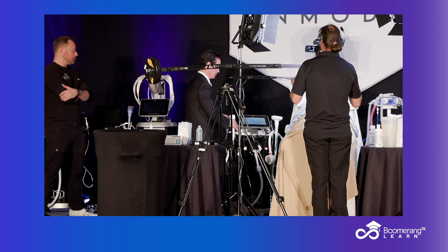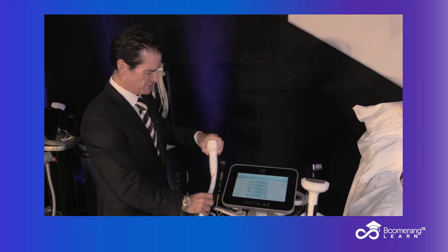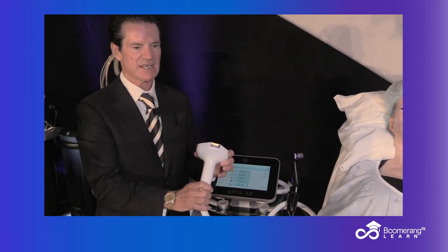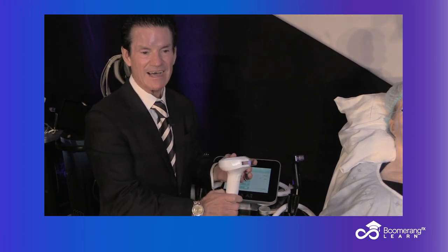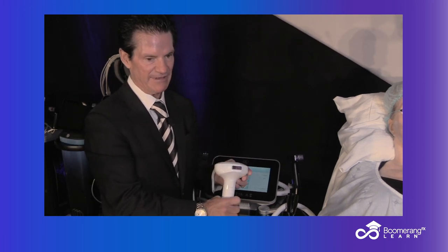We have looked at laser hair removal and the diode on the Optimus. And we are going to now look at one of my favorite energy-based devices: IPL photorejuvenation, or photofacial. On this type of skin type 1, 2, 3, I'd be using the 515 cutoff filter. For a darker skin type 4 or 5, I'd use the 580.